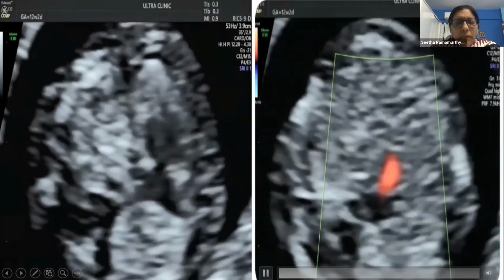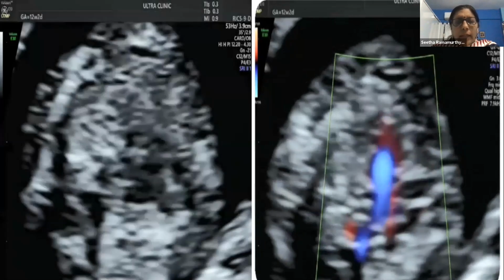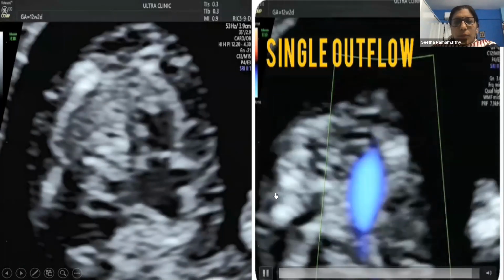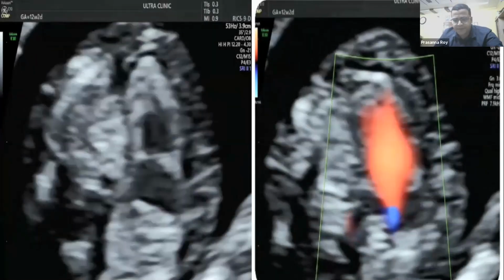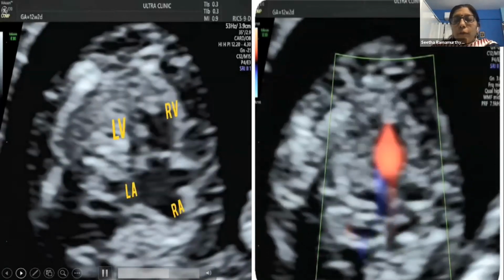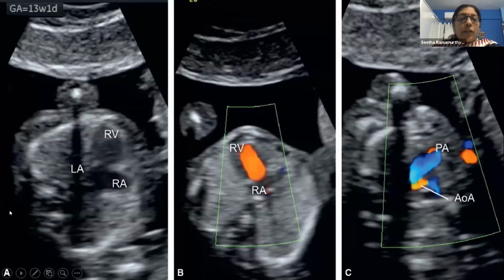So basically, we can see that the 4 chamber is looking grossly abnormal, with the left side of the heart being very small and underdeveloped. Can you show me the 4 chamber color flow as well? Well, it looks like there is no flow across the mitral valve. Yes, ma'am. And possibly a regurgitant flow across the tricuspid. So this will fall into the category, as we've seen earlier, of hypoplastic left heart syndrome, where there is basically gross maldevelopment of the left side of the heart with disruption in the systemic circulation.